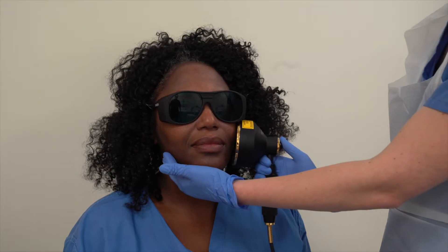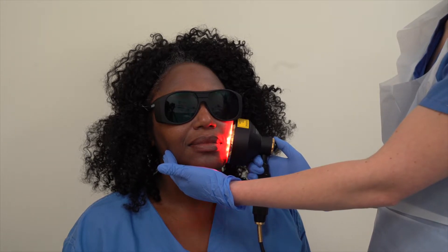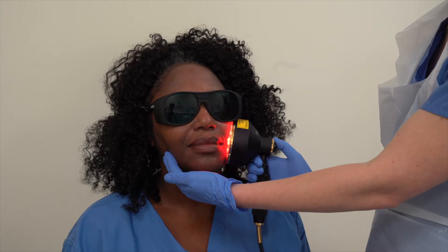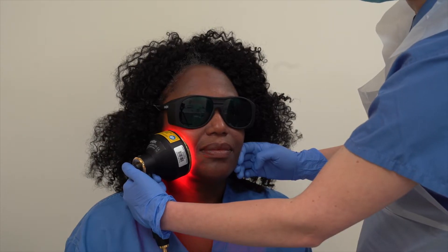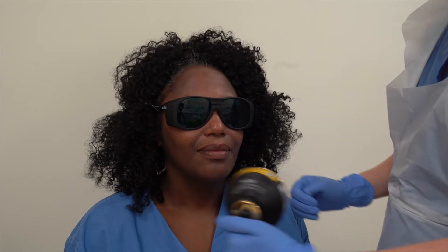Patients should sit up in bed or on a chair at approximately a 45 degree angle. There are three treatment sites with the extra-oral probe: over the left cheek, over the closed mouth and chin, and over the right cheek. For each of these sites the LED should be activated for the preset one minute and should terminate before moving on to the next site.